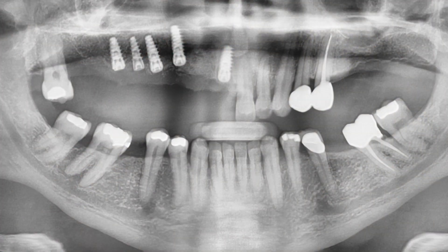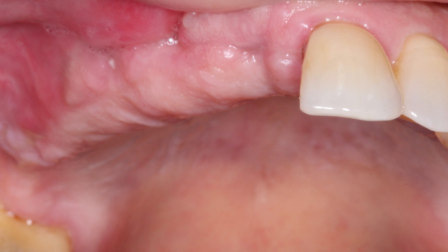We see the postoperative panoramic radiograph illustrating the positioning of the Han tapered implants in the maxillary right quadrant. After a few short weeks of healing, the tissue responded well and was pink, firm, and healthy.